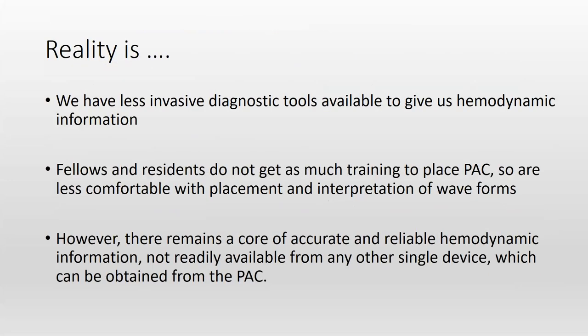So the reality is, we have invasive diagnostic tools available to give us hemodynamics, and less invasive diagnostic tools available. Fellows and residents do not get much training to place pulmonary artery catheters, so the next generation of residents and fellows, including me, are less comfortable with placement and interpretation of waveforms because we just don't see as much. But there remains a core of accurate and reliable hemodynamic information not readily available from any other single device, which can be obtained from a pulmonary artery catheter.